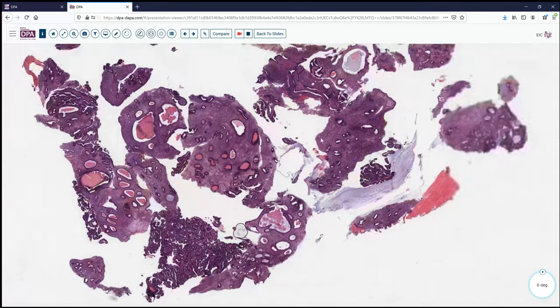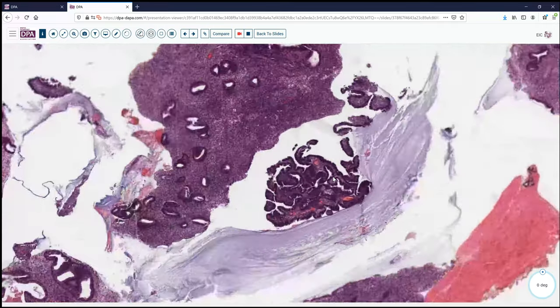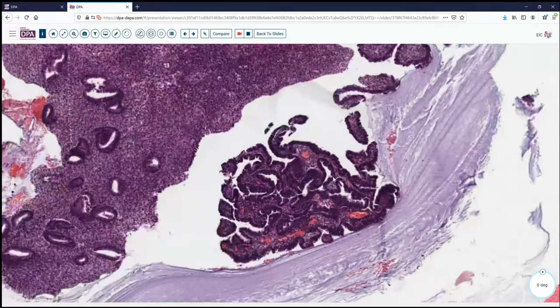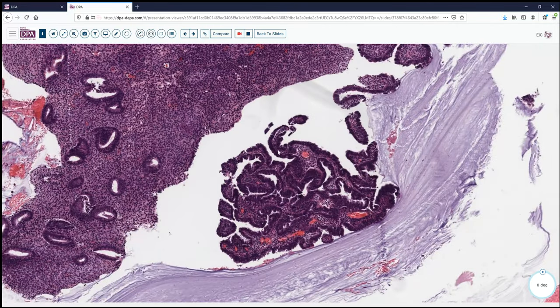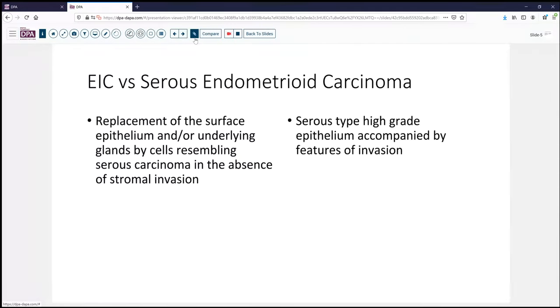So then the question is, what classification does it fall into? Because with serous lesions, we have two baskets we can put this into, which are illustrated here on this next slide.